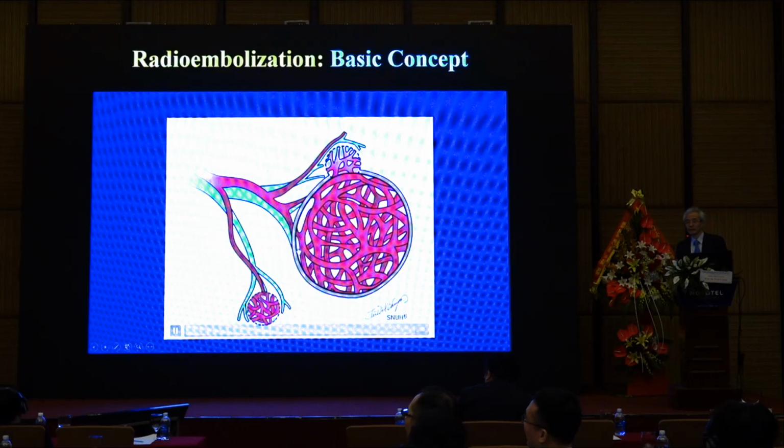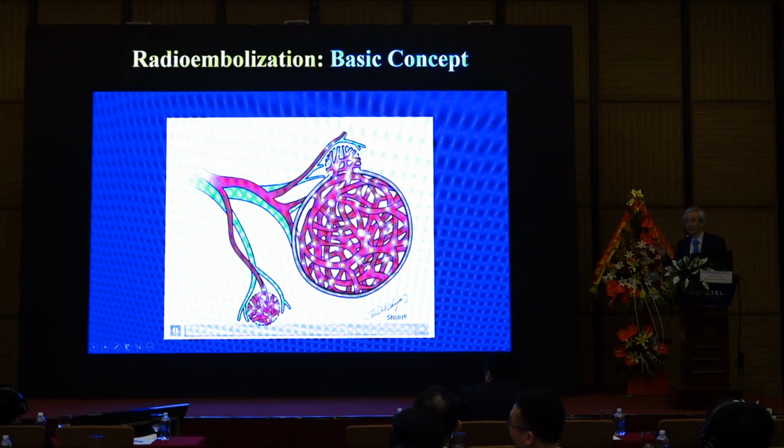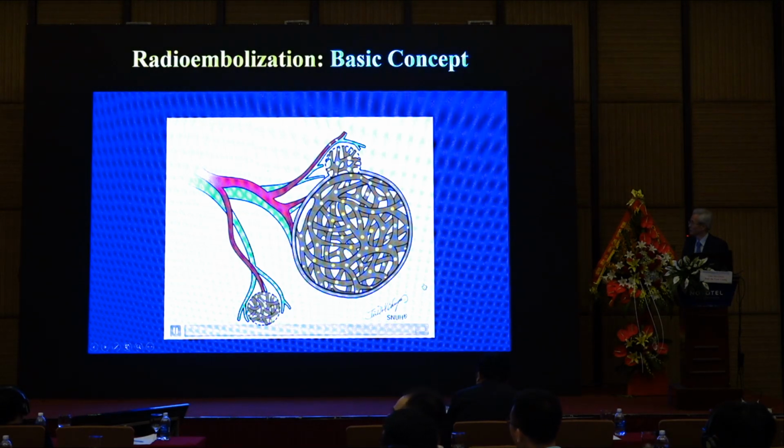This slide illustrates how it works. These radiating particles are very small. This is 35 micron. So it usually never embolizes tumor vessels. It is deposited in the tumors and then radiates beta rays and then devitalizes the tumor slowly, not immediately.